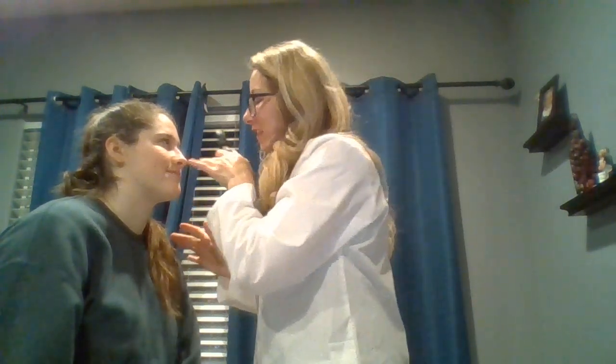Everything looks good. I'm looking for the red eye reflex as well, which is present. The optic disc and the cup and the associated blood vessels are both present, and so is the red light reflex in the other eye, and your iris and your lens look good.